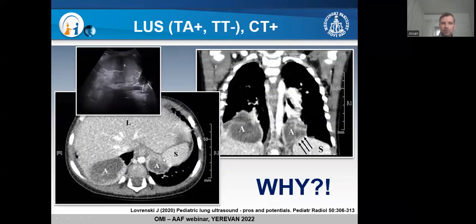And look at it. Of course, we saw this abscess within the right lung base very easily. But why didn't we see this left lung base abscess while we were using transthoracic approach? There is the solution. You can approach only to this circumference of left hemithorax.